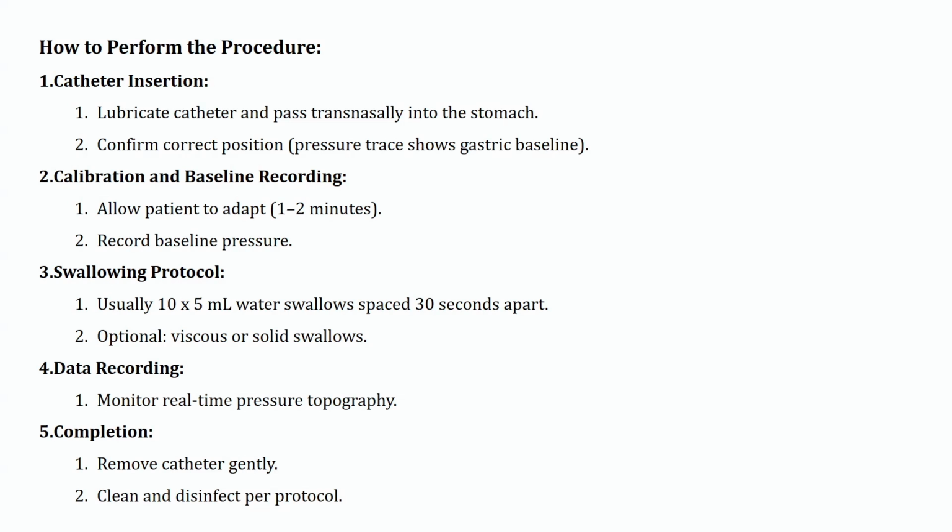Then we can see the real-time pressure topography. This is the good thing about manometry: we are seeing the pressure in real time. And I will show you in the next slide how it will look during the insertion. Then once we finish the protocols, we have to remove the catheter gently. If it's a reusable catheter, we have to start cleaning and disinfecting immediately as per the manufacturer's protocol of the catheter itself.